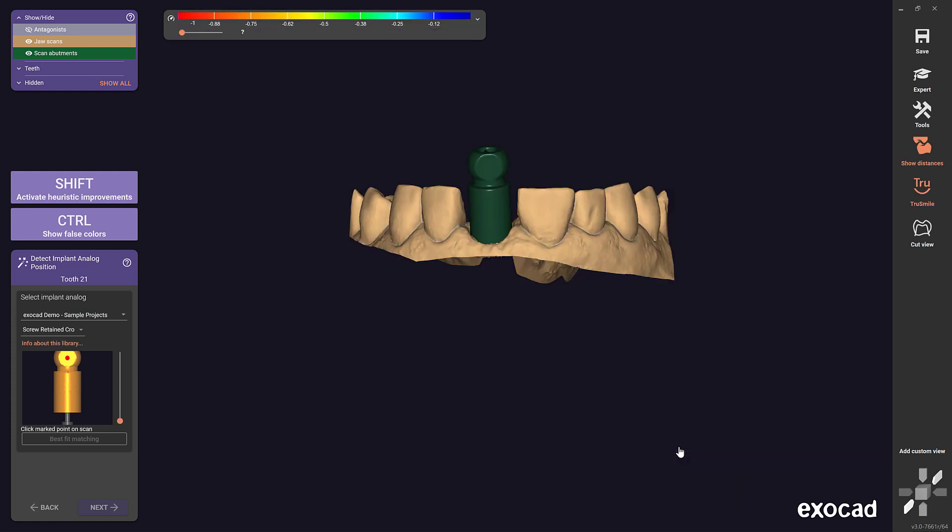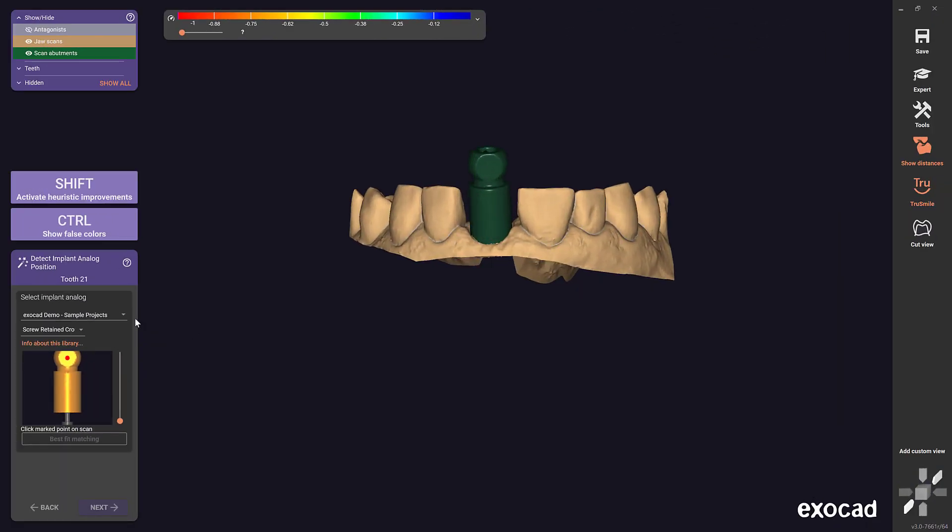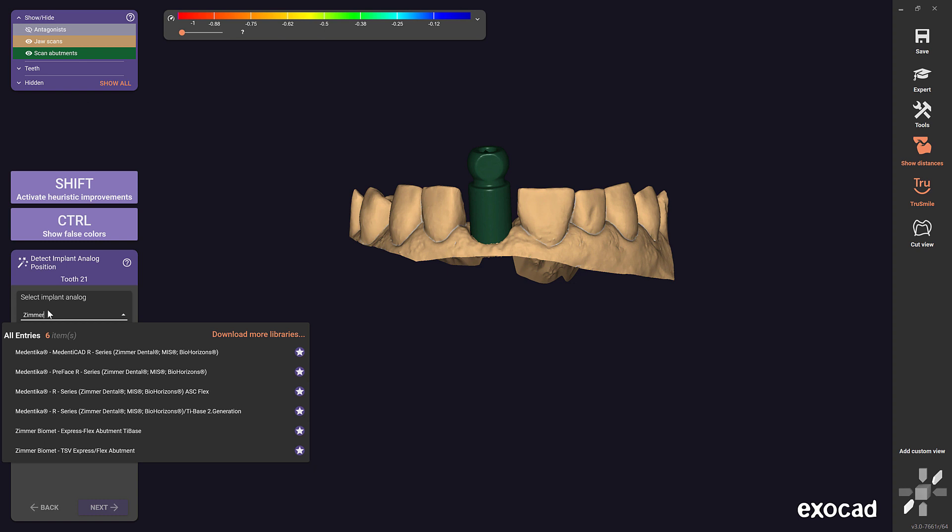Note: library downloads are available at no additional cost for those who have an active upgrade contract and for all users of flex licenses. Also, this easy library download feature is available for implant components libraries, model creator libraries, and denture teeth.